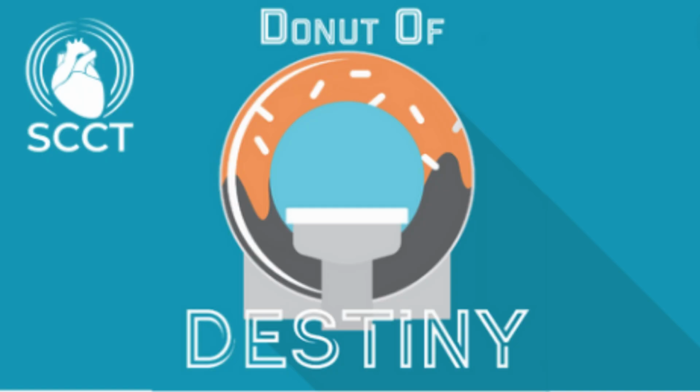So we generated a patient-specific CFD model to better understand how blood might flow around the coronaries, and it really helped reassure that there would be flow on the outside of the CoreValve and that we would not obstruct the coronaries. So it's a really neat potential for device selection and predicting what can happen in some complex redo TAVR situations.